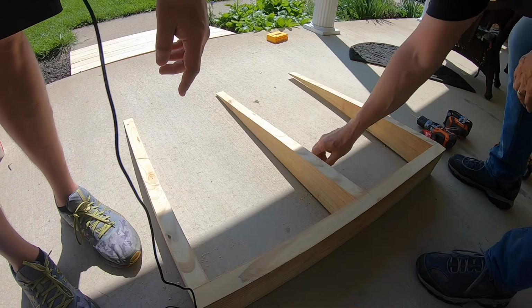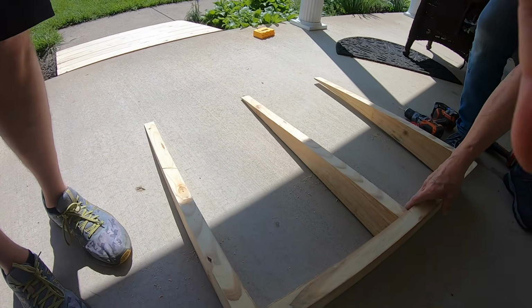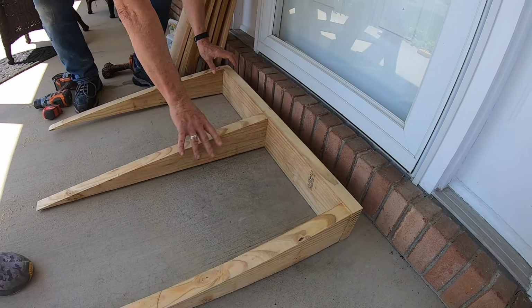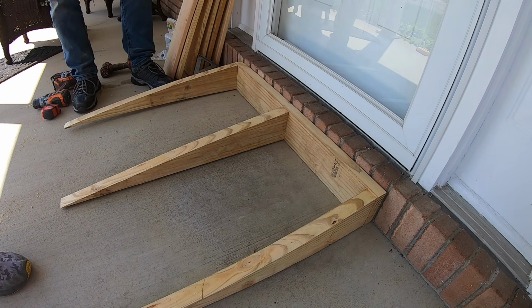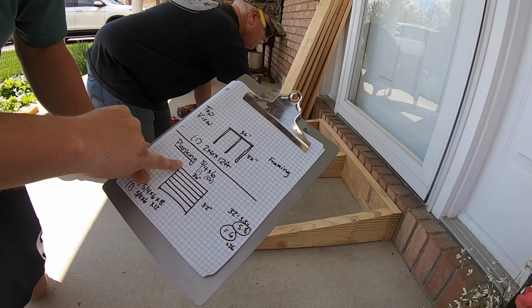The next thing we're going to do is go ahead and put it back up to make sure it still looks good and is right where it needs to be. So we'll go ahead and scoot that, just give another double check, make sure all of it looks good and exactly what it needs to be. So the next thing we're going to do is go ahead and work on the planking.